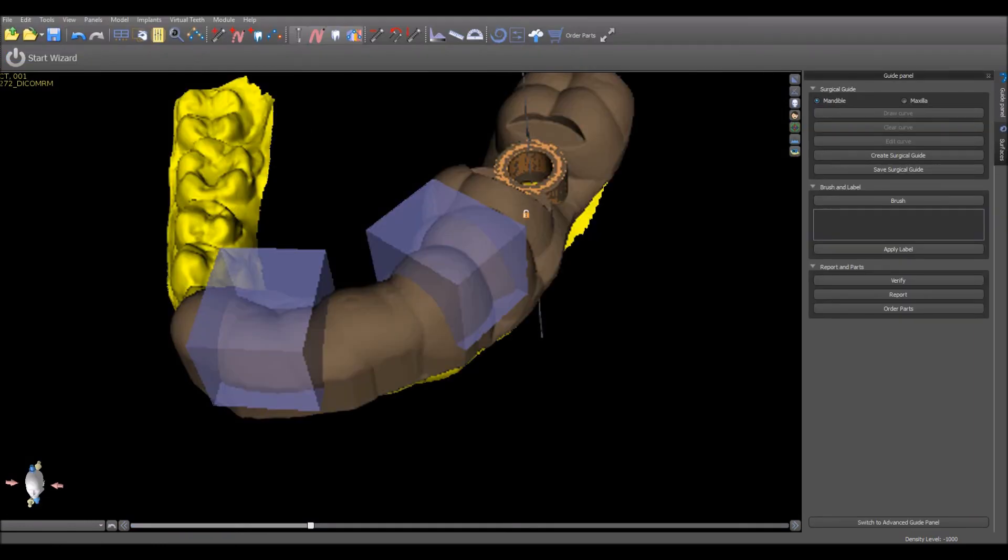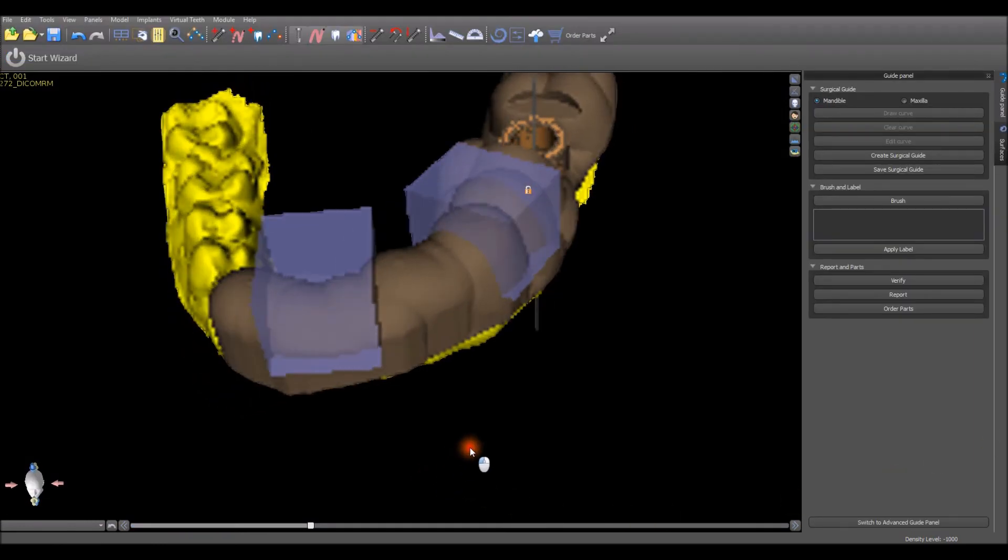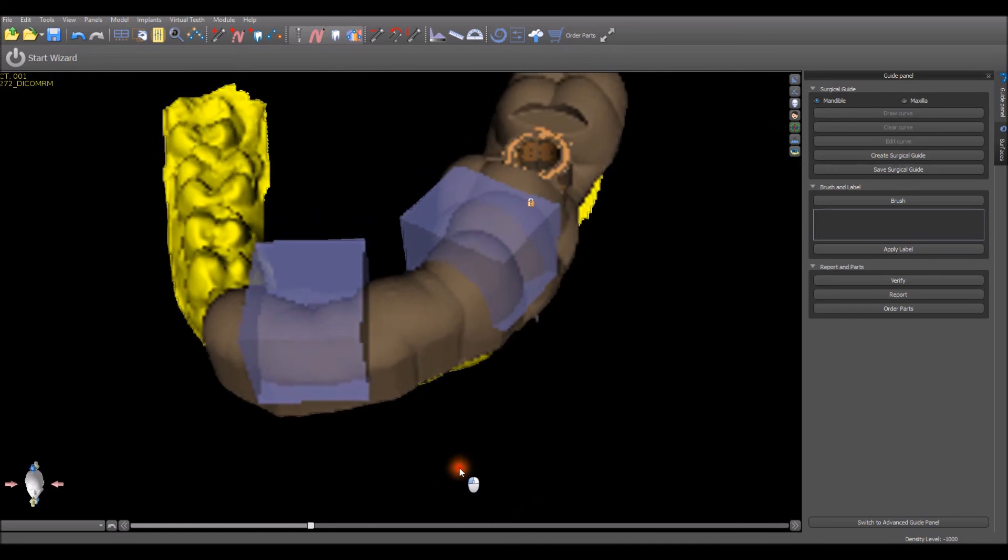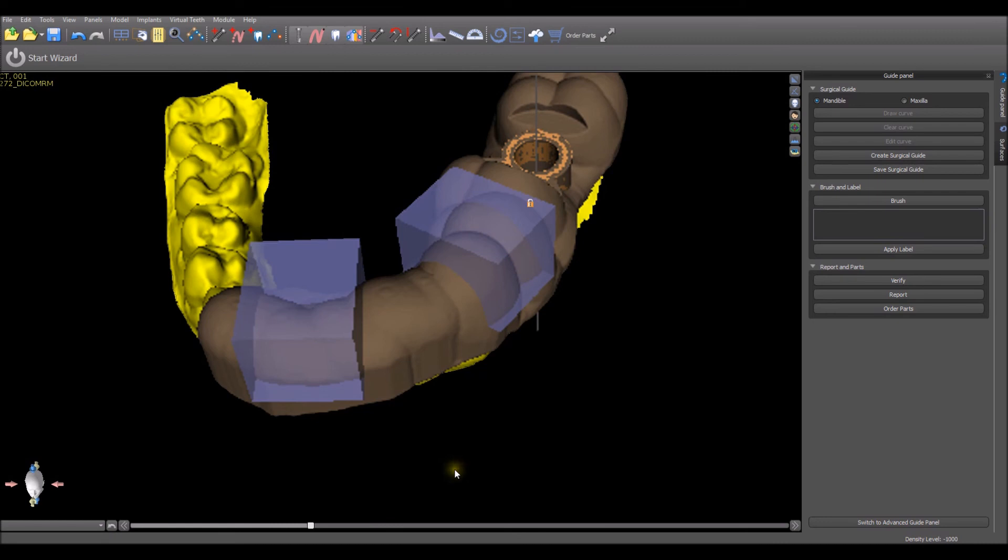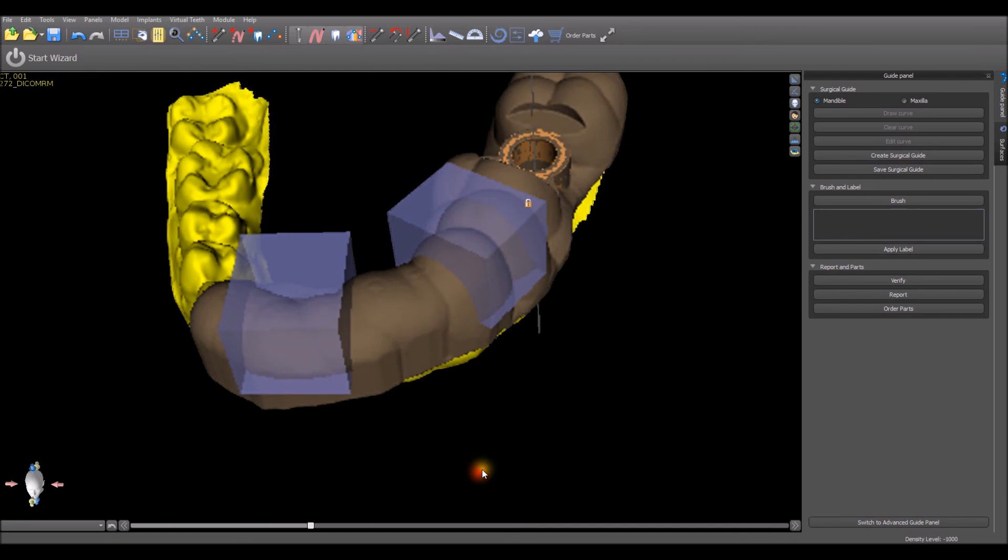If you are not using the wizard, the process of placing the blocks, resizing and rotating them is the same as in the wizard. However, to fabricate the surgical guide with the windows, once again press the create surgical guide button.